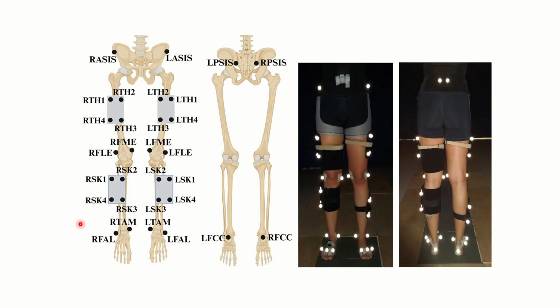Tip number 6, motion capture markers. So there are a bunch of predefined marker sets that you can use. You can check the Visual 3D Wiki by C-Motion. You can check a bunch of research papers, or you can even look at your motion capture system software, which may offer predefined marker sets depending on the part of the body you are analyzing.